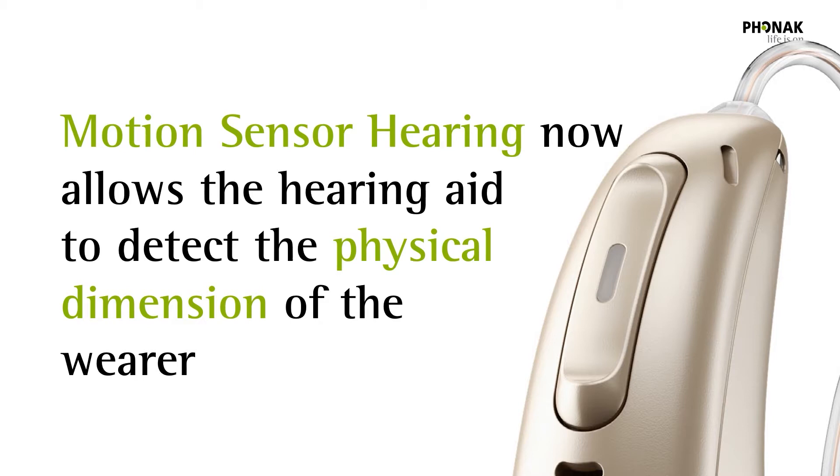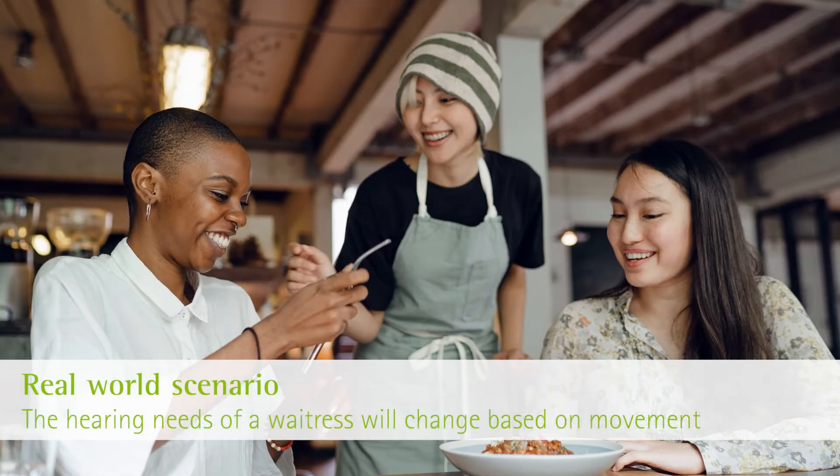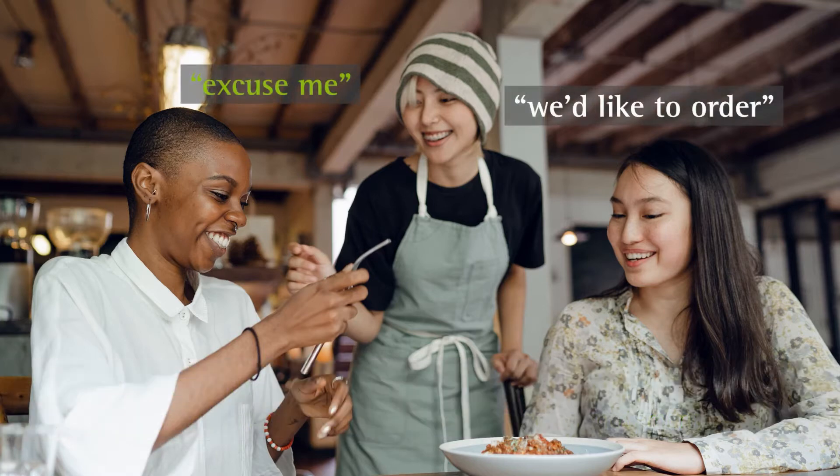The automatic system can be even more responsive to the hearing aid wearer's needs because those needs will change in accordance with what they're physically doing. A good example is a waitress with hearing loss working in a busy restaurant. As she moves around the restaurant, it's quite common for customers to try and get her attention, so hearing well from all angles becomes the priority when she is in movement.